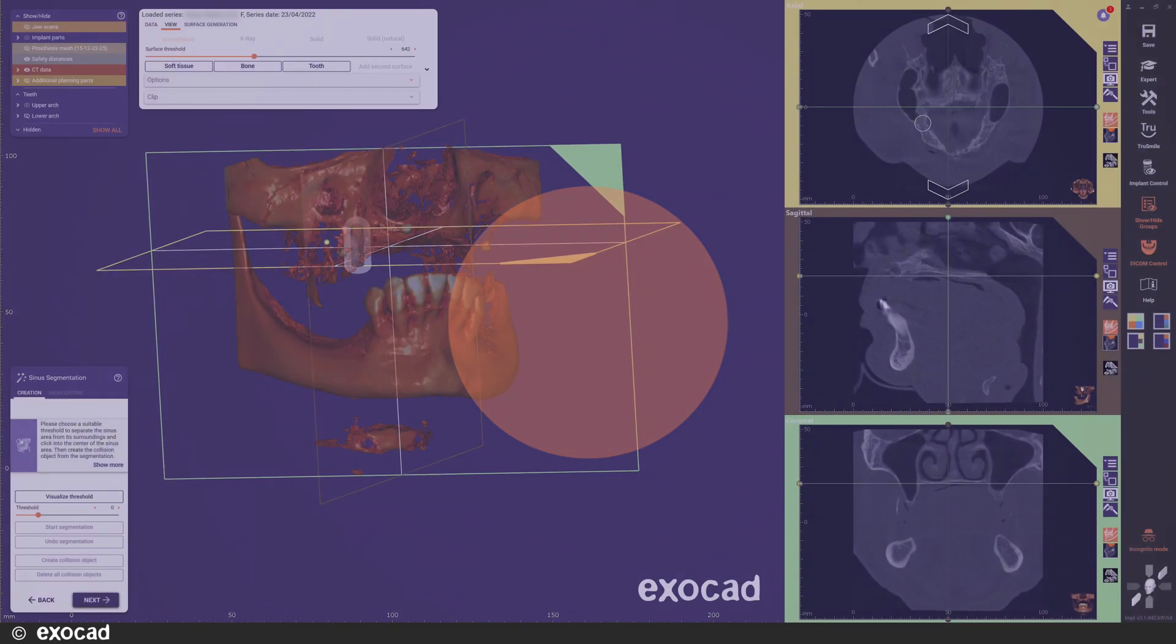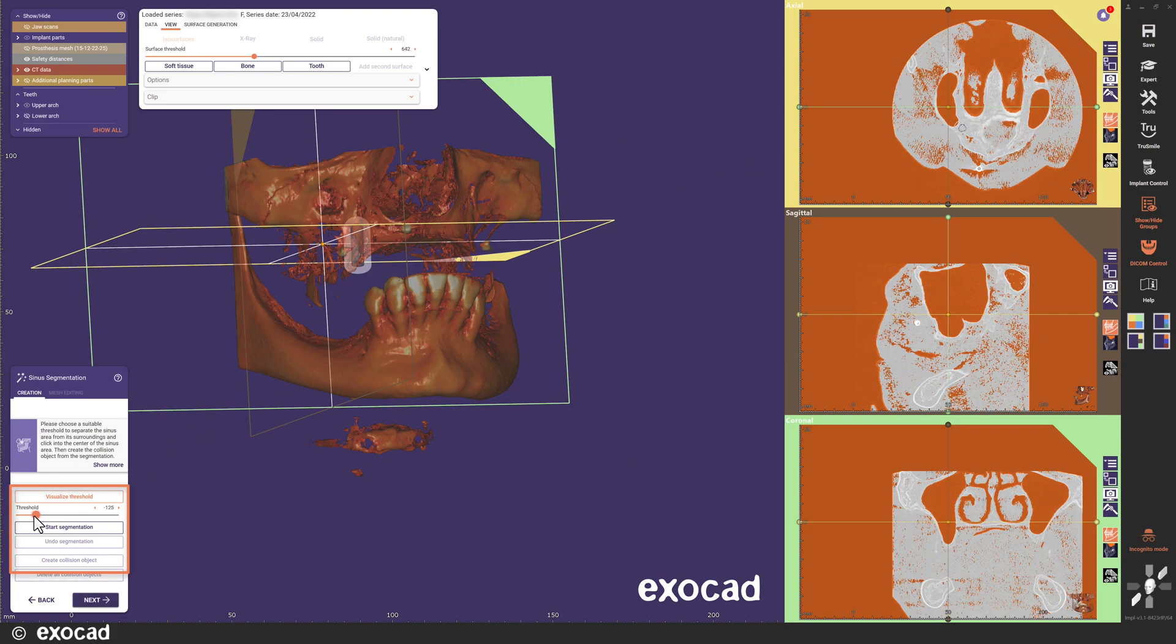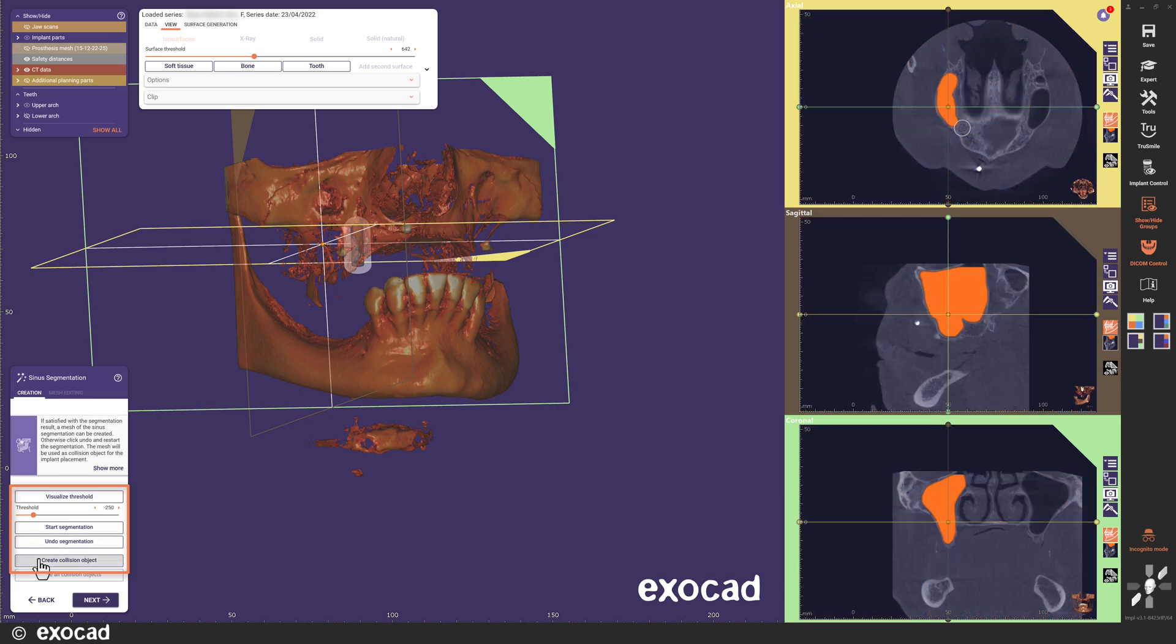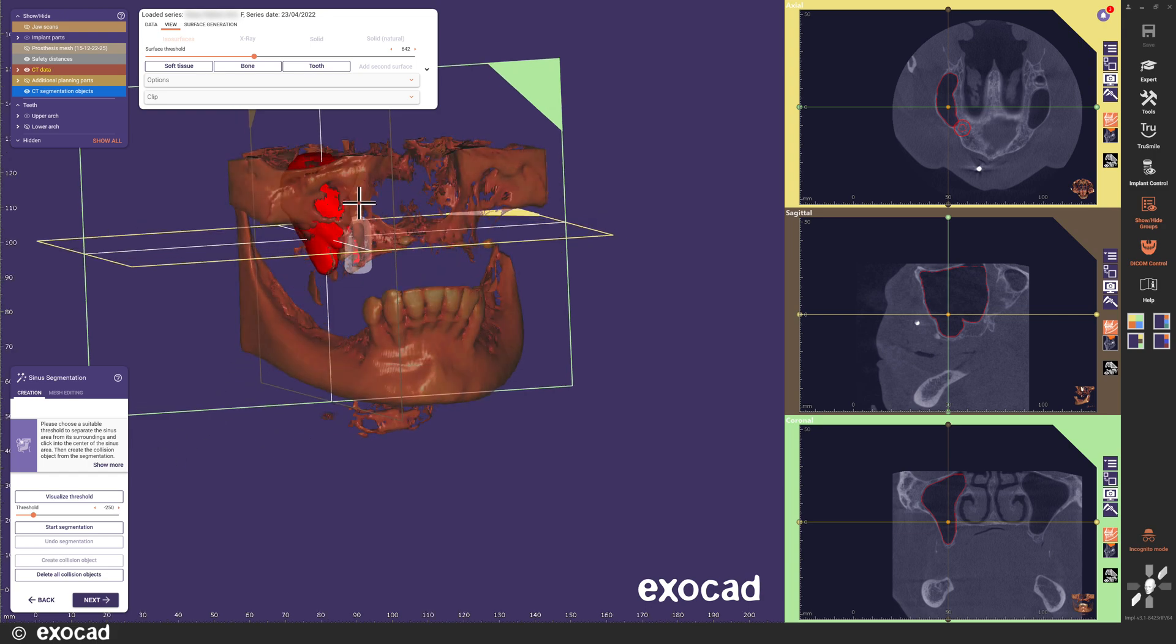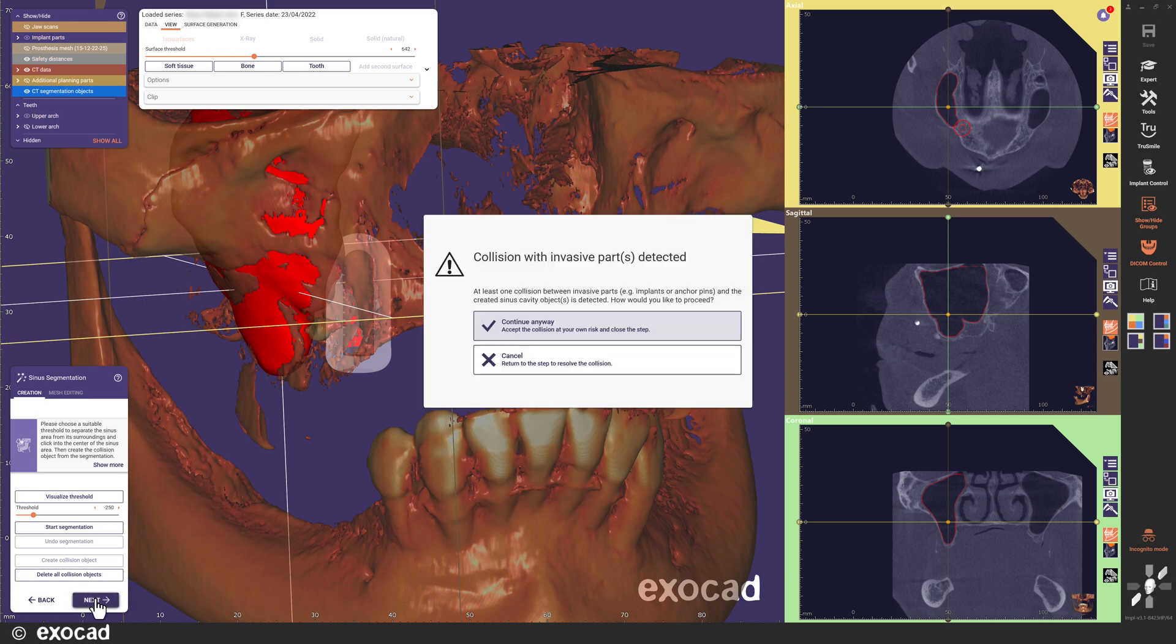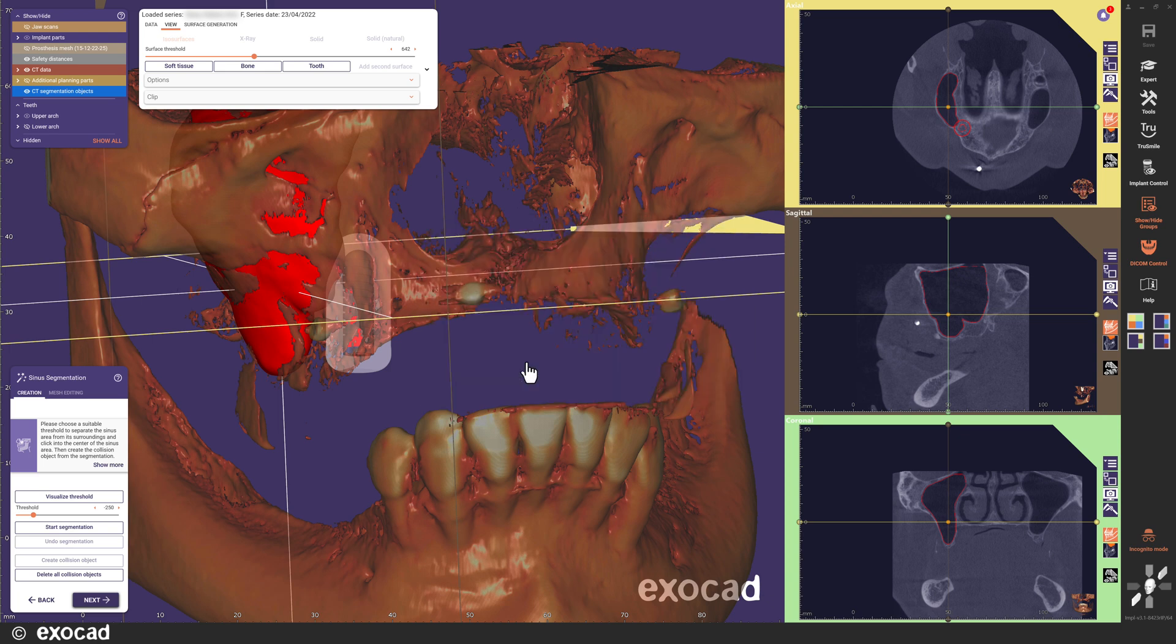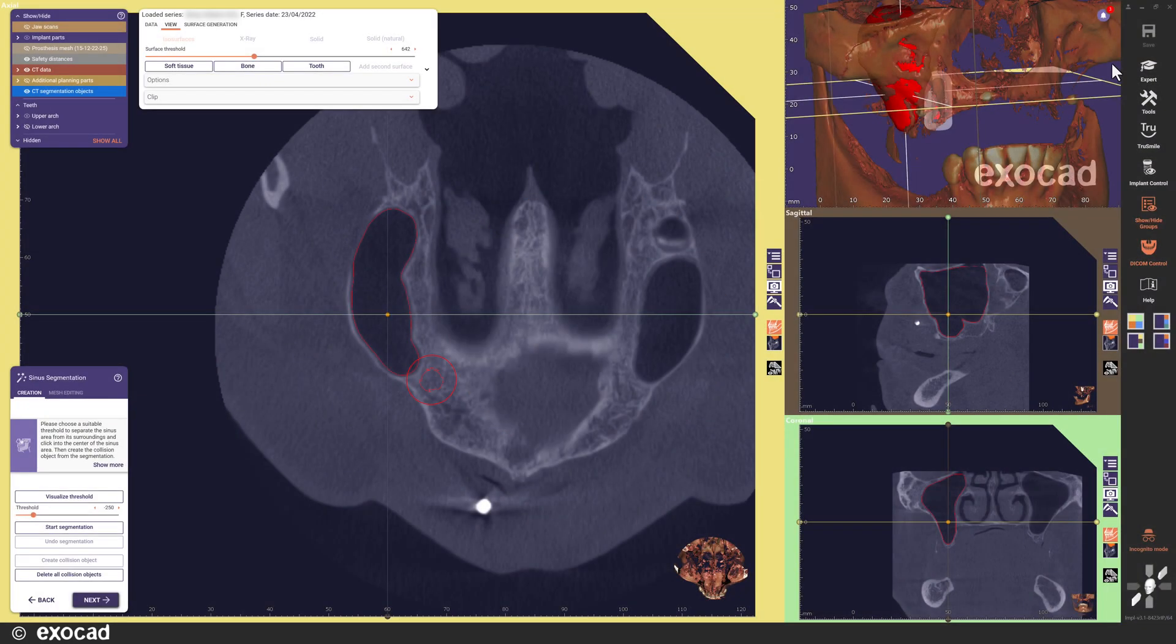Let's continue to the next step, which is the sinus segmentation step. I place the seed point, check the threshold and adjust it. Then I start the segmentation and create the collision object. As you can see, when I created a mesh object for this sinus, I got a collision with the implant I already placed in the rapid preplanning mode. In Exoplan 3.1 Rijeka, you can continue even if you have a collision with the sinus object. It will be mentioned in the report, but maybe you also want to add a screenshot of the area to the report.